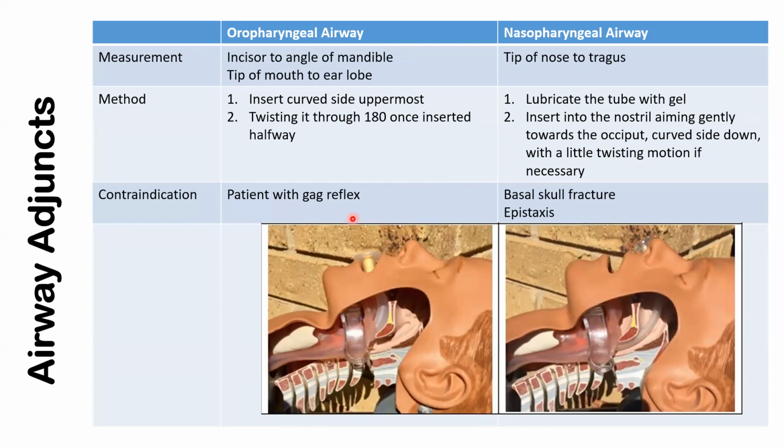Clinically, the patient will have tachypnea, then maybe stridor. Definitely they have labored breathing, but mainly the stridor will tell you that there is some sort of obstruction needing an adjunct to the airway. Or it can be together with your bagging. You're going to bag a patient to keep the airway open instead of using your hand maneuver, so you can put that in to help with the airway patency.